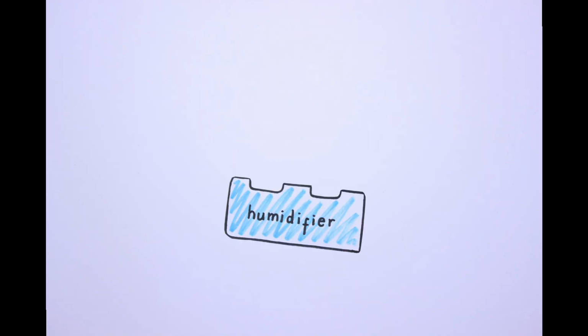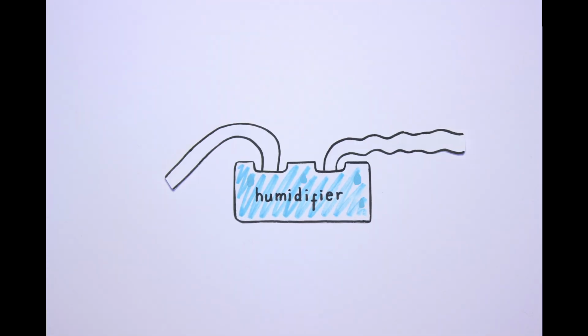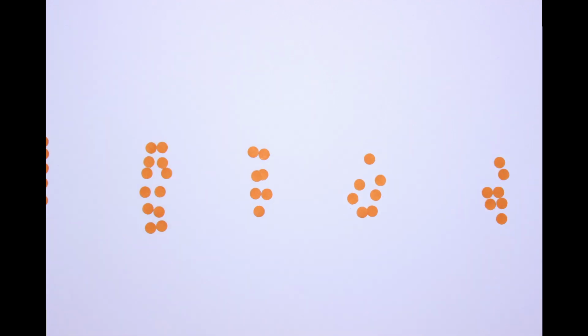There's usually one more thing between a ventilator and a patient, and that's a humidifier. This makes sure that the air going into the lungs is not too cold and not too dry. And a doctor can change the settings to suit the needs of the patient. They can change the amount of gas being pushed out on each breath. This is sometimes called the tidal volume, so they can create big breaths or small ones. They can also change how often the ventilator produces a breath, the frequency of the breathing.